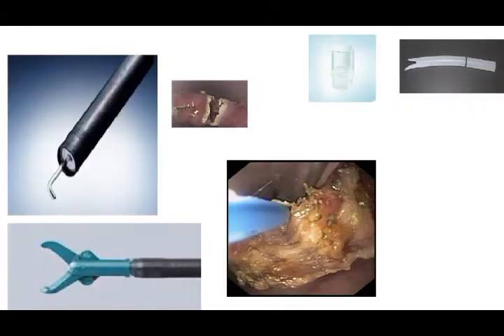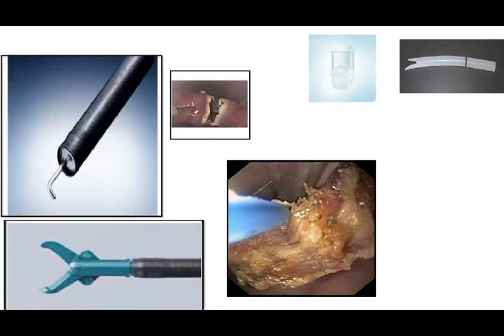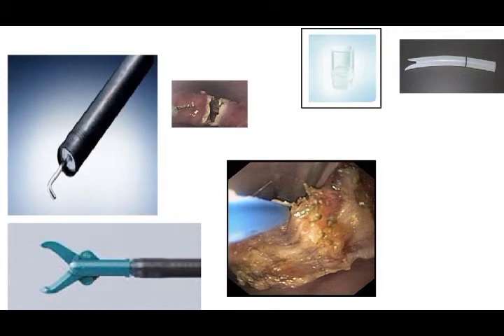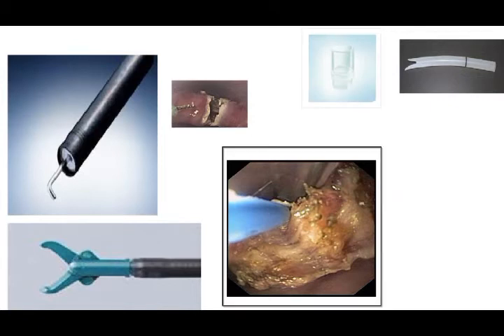Since then, many variations of technique have been reported, and a wide array of cutting devices have been used. A soft diverticuloscope was used in some, and a transparent cap in other series. Some even have used argon plasma coagulator to ablate the cricopharyngeus muscle. All of these studies were small case series, with variable outcomes in success, adverse events, and recurrence. There was no clear evidence supporting one technique or device over the other.